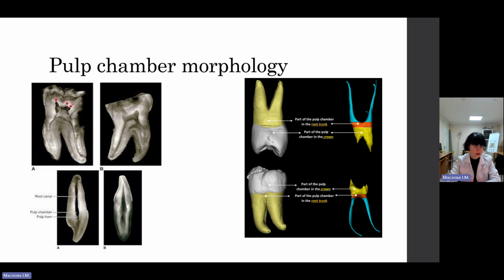The first image shows you the routine method of dental investigation through X-ray radiography. And the next image can show you the 3D modeling. It's a lower molar and upper premolar. For example, access to the root canal system involves both coronal access to the pulp chamber and radicular access to the root canals, through the root canal orifices.